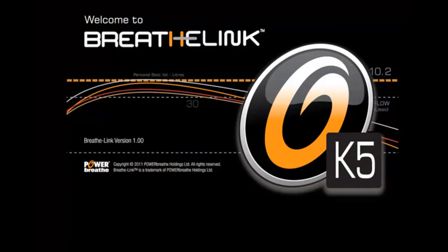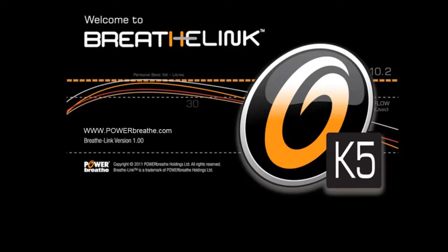This concludes this video tutorial. For further information, please consult your BreatheLink manual. Alternatively, visit powerbreathe.com to learn more about the benefits of IMT training.